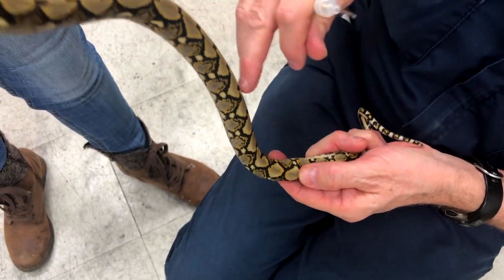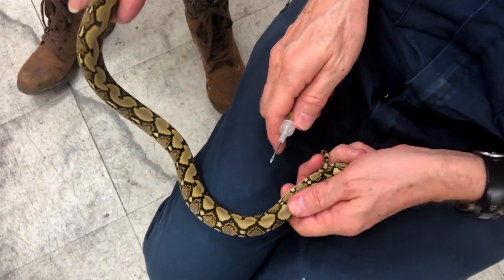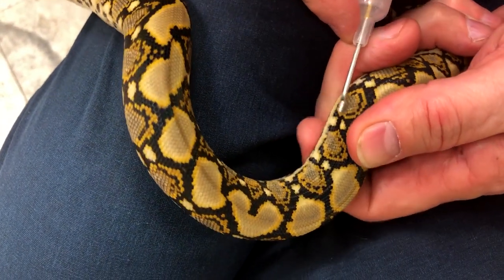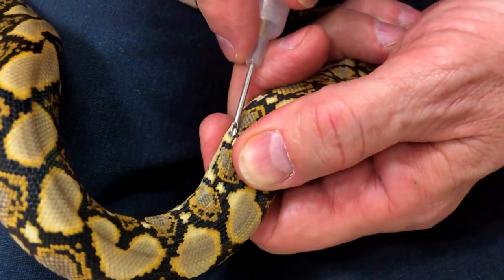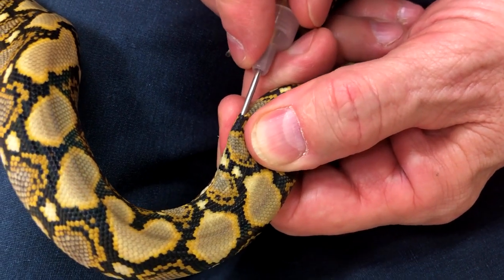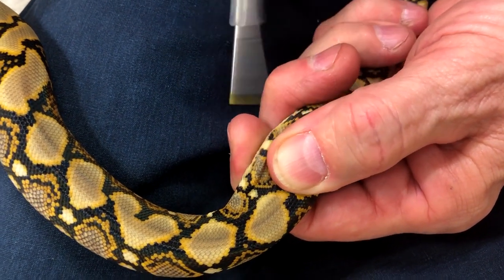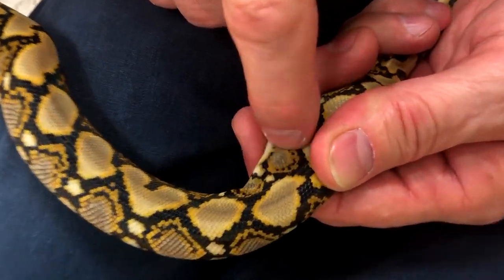You have to get down here. I'm just going to go right here — we're going to go in between the scales. He ain't going to be real happy about this. I'm just going to go up inside him just a little ways like that, push it off in there, and come back out. And there's a little microchip right inside of him.